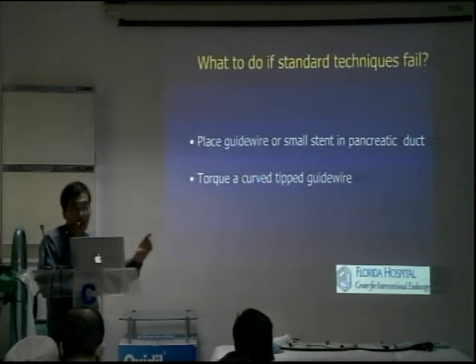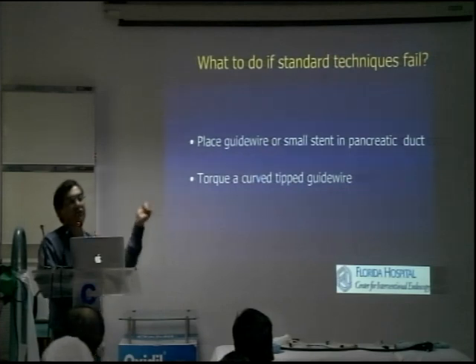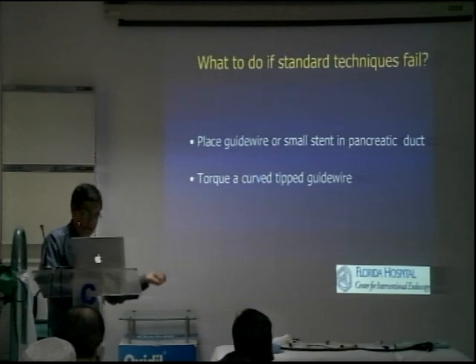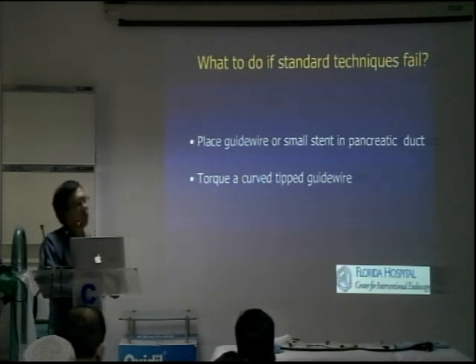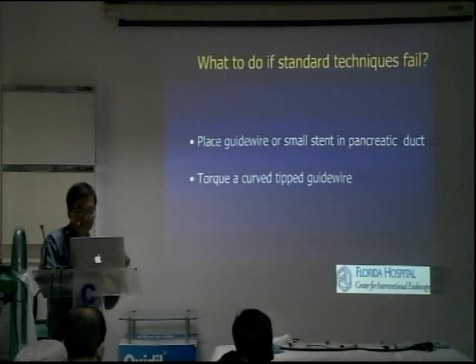So sometimes it could be a problem, but with the pancreatic stent, now at least you have saved the pancreas, and you can do some other technique like needle knife if you have to. That way the pancreas would be safe, with less risk of pancreatitis. If for any reason you have to stop the procedure, the patient is unstable, or bleeding happens, at least the pancreas is safe in that case.